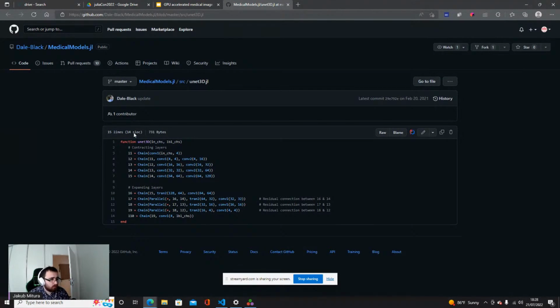But how does the U-Net work? Basically, for those that do not know, this is how Flux constructs the neural networks. We have Chain, which creates basically the composition of the functions. So we have L1, then we chain L1 with L2 and L3, and so on. We chain to the end.